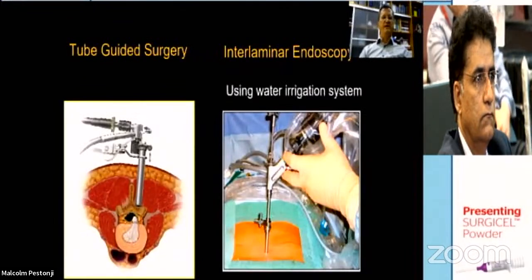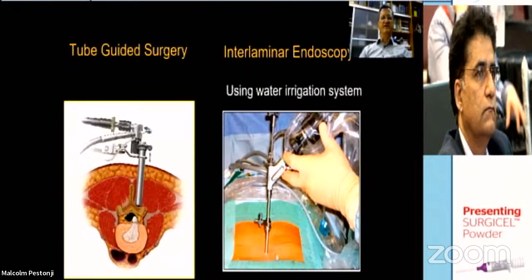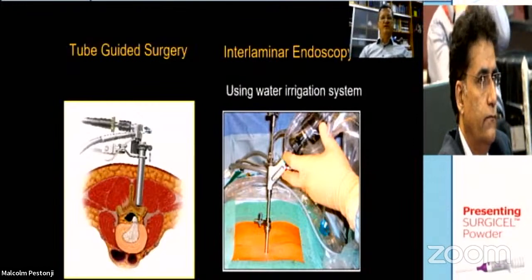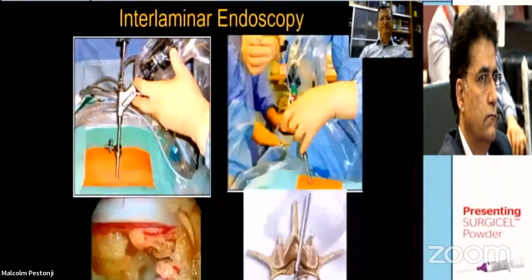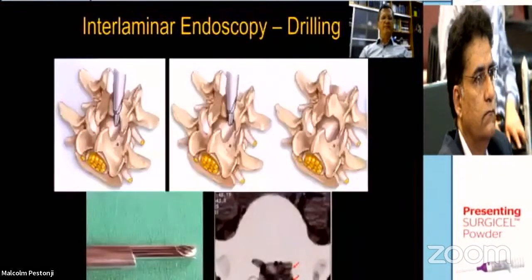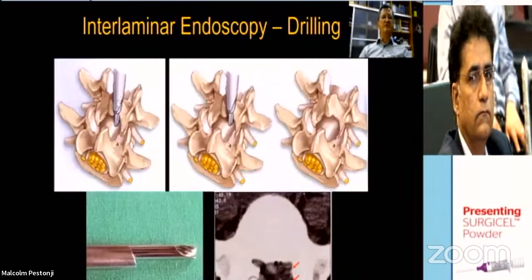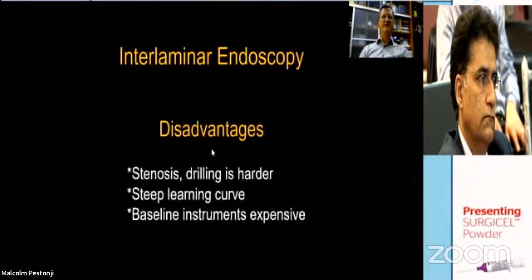If you compare the systems, this is a very different system using a water irrigation system. Tube diameter is about 7 millimeters. Here, diameter is about 14 to 16 millimeters or larger. This is Ruetten's depiction of the surgery. Actually, you can also adapt some high-speed drills to that system. But disadvantages are stenosis treatment is harder, there is a steep learning curve, and baseline instruments are expensive.